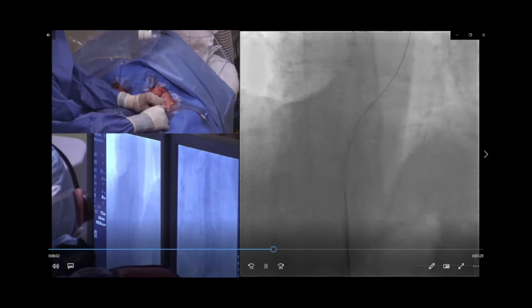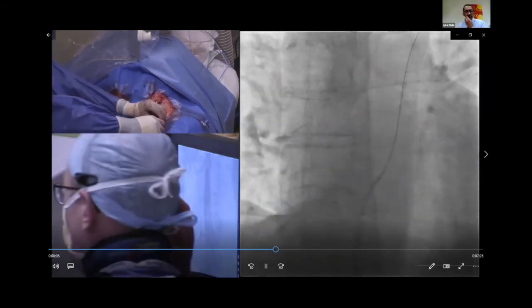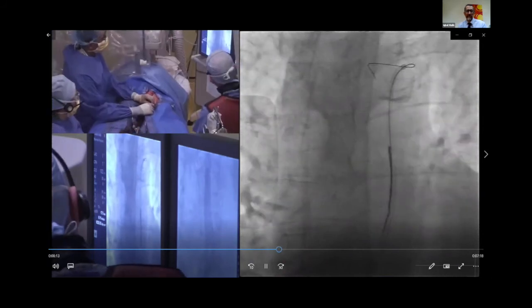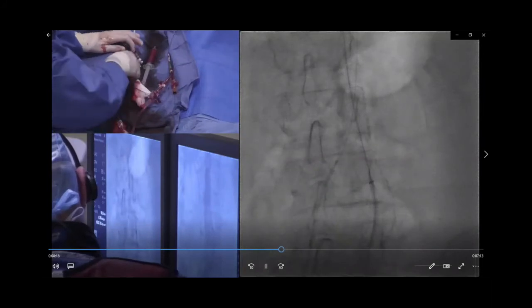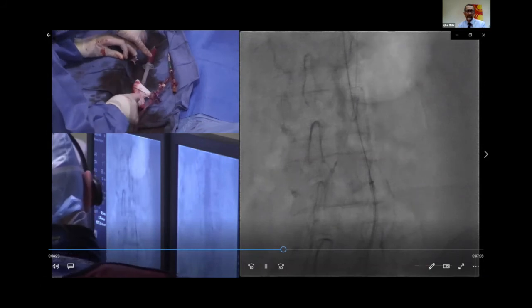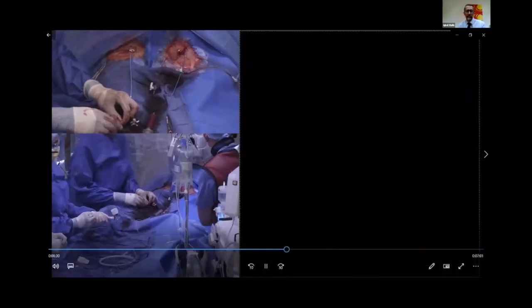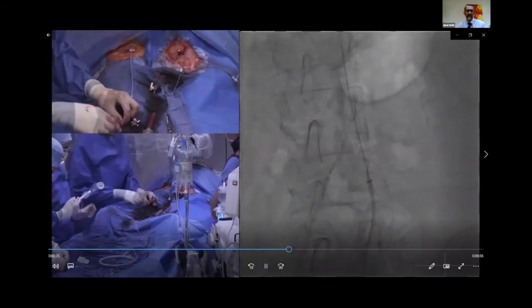Yeah, it exactly is. So basically the diathermy that you might have the pacing guys using to tidy up the wound, or the surgeons using as a cutting and coagulation diathermy, we use cutting diathermy. So you put a pad on the leg, and it's basically exactly the electrode paddle that the surgeons use to cut, so it's available in your hospital. Just scrape the end of the wire, clamp it to the paddle, and it's one small press on the knob to do the cut for just a second as you push.